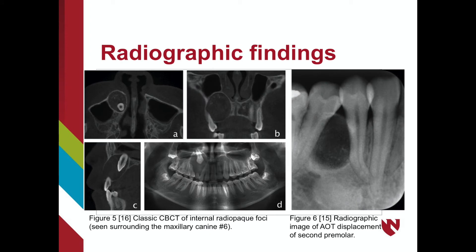In Figure 5, we see a CBCT demonstrating a classic AOT. Shown are the internal radiopaque foci surrounding the maxillary canine. However, in the panoramic image D, we can only see a few thin radiopaque lines representative of these. Notice the enlarged interdental space, the displaced roots of the lateral incisor and first premolar, and the absence of root resorption.